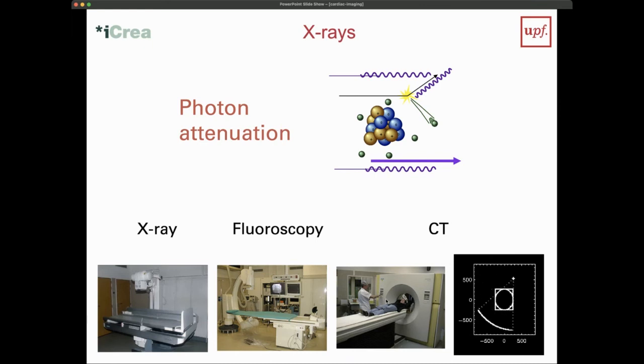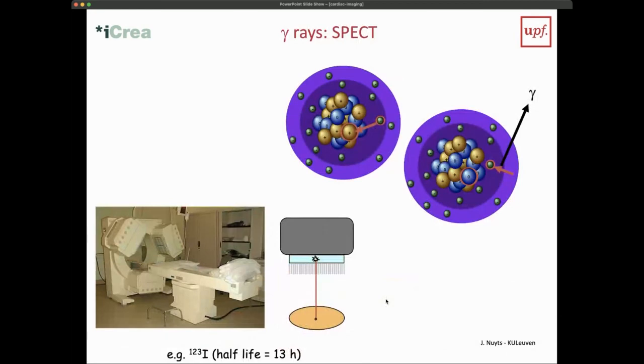X-ray attenuation is done by atoms. So it's an attenuation of photons with the atoms, with the electrons, with scattering from the atoms. So X-ray imaging looks at atomic concentrations. That makes discriminating soft tissue, and for example discriminating blood from tissue, very difficult. So we probably will need, as we will see later, contrast agents in order to do that. So that's intrinsic to the imaging modality.